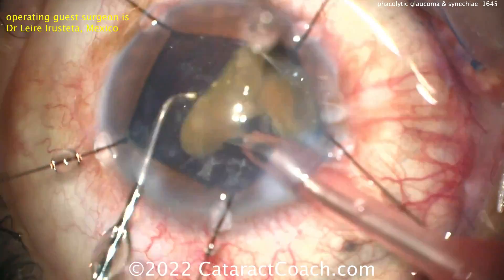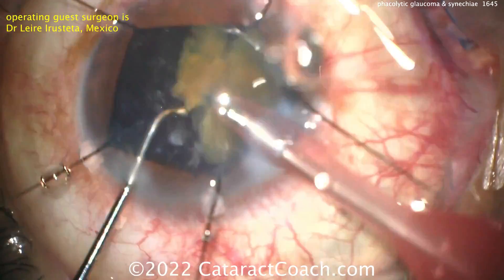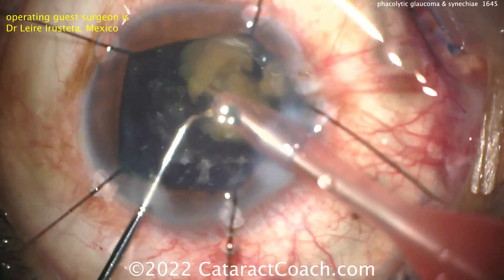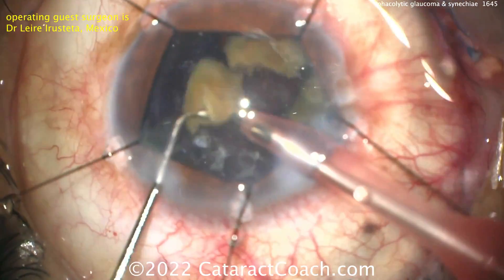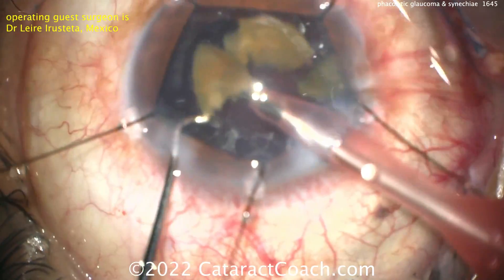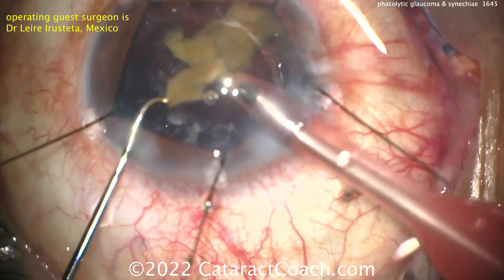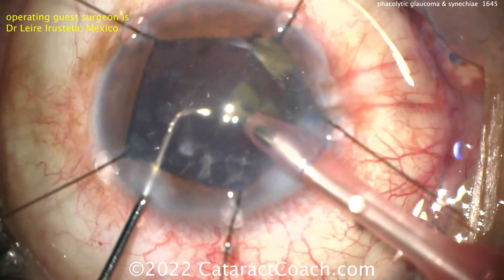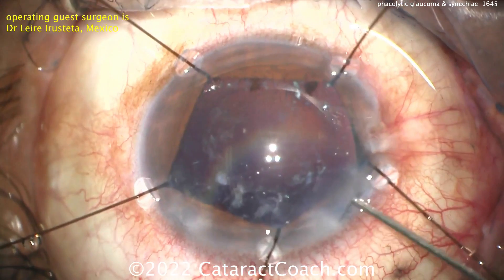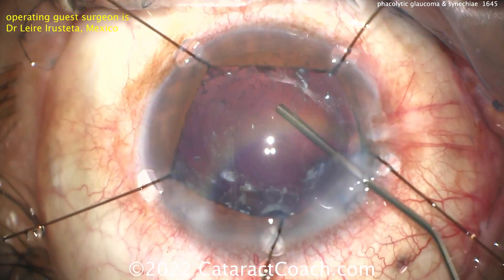I like the patience here — of course we sped the video up, because you want a five-minute video, plus or minus, right? Interestingly, look at the capsule bag: some fibrotic changes, some scarring. Also look at those little sparkly things — looks like some crystallized proteins, maybe calcium or crystallized protein, something related to that facolytic glaucoma or the liquefaction of all of the lens cortex.